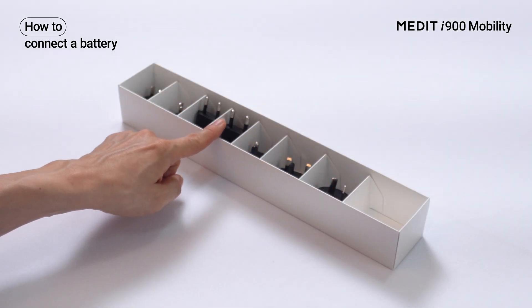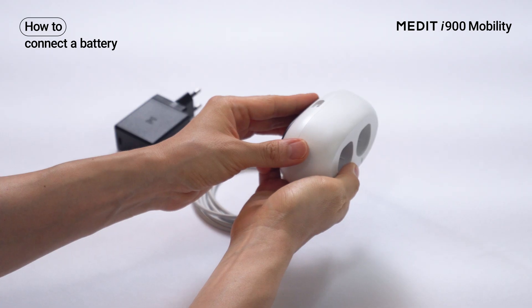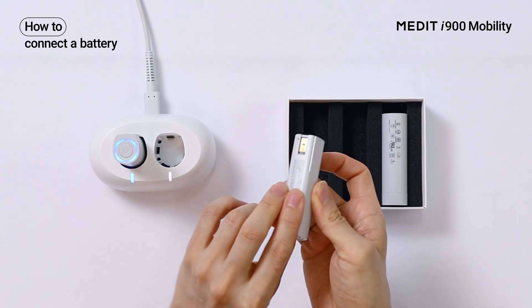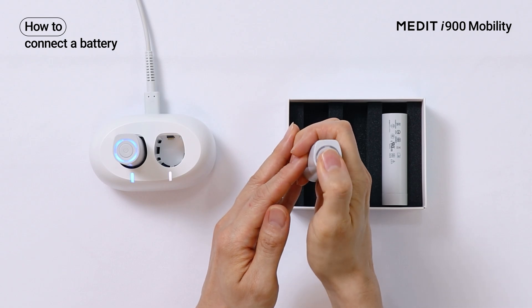First, connect the power connector that matches the local mains voltage to the power adapter. Plug it in, then connect the white charging cable and the battery charger. Insert the battery into the charger. Check the LED on top of the battery to confirm charging status.